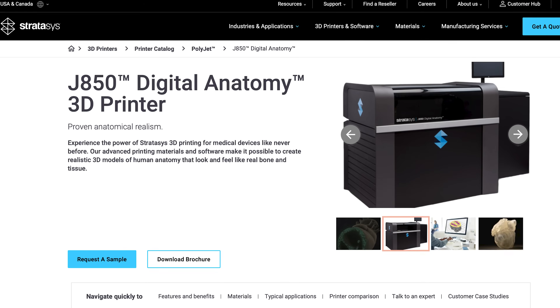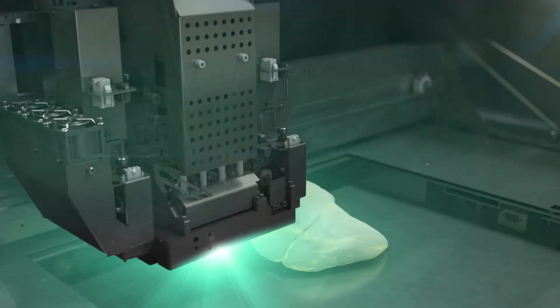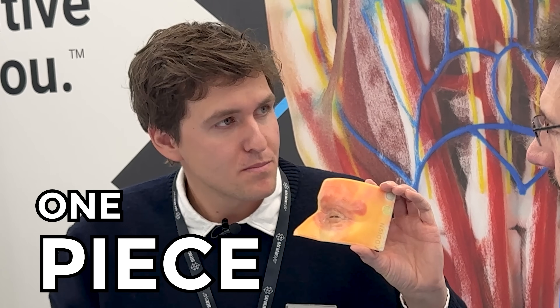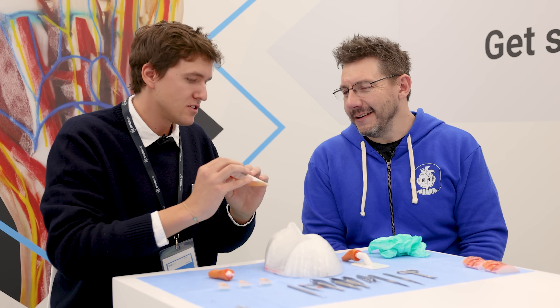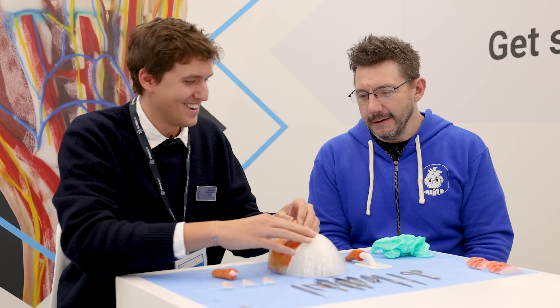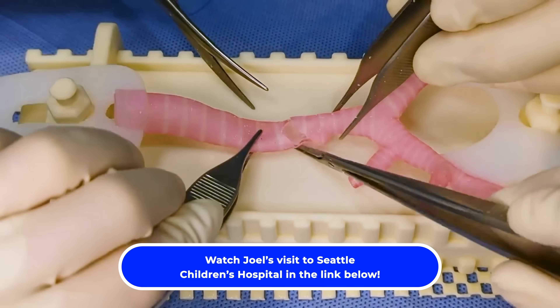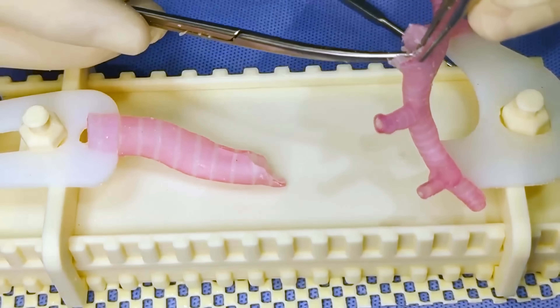We're going to cut it open and take a look at how it was made. For something like this, the machines and materials that make it possible are the J850 DAP - a Digital Anatomy Printer - and the Agilus range with the DAP materials: tissue, gel, and bone matrix. All of that is together in this model, printed essentially as one piece. It comes out of the printer, gets cleaned, support removed, and it's almost ready to go. We can mix all these materials together to create different hardnesses - shore values, colors, and densities - to simulate anatomy really, really close.